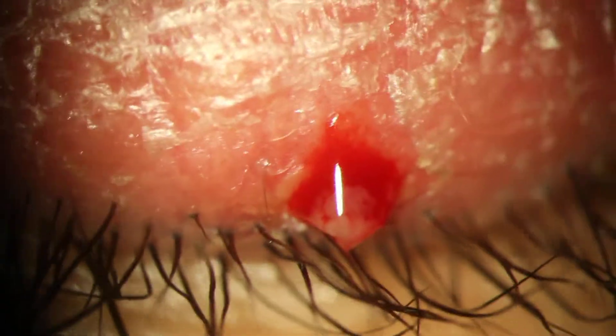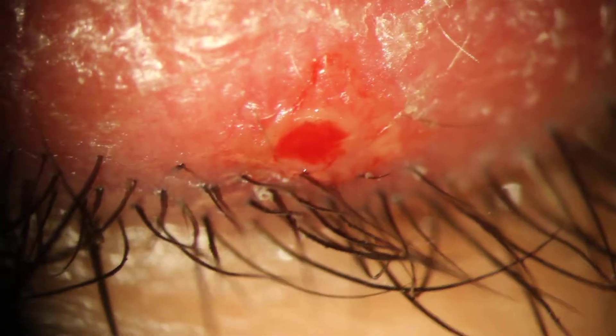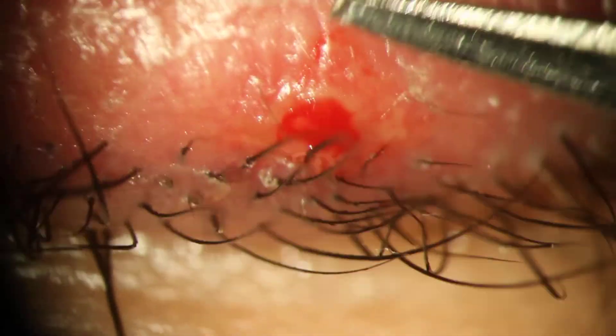You getting this on video? Yeah. Good, I'm just kidding — like Dr. Pimple Popper. Here we go, I'm going to push a little bit.